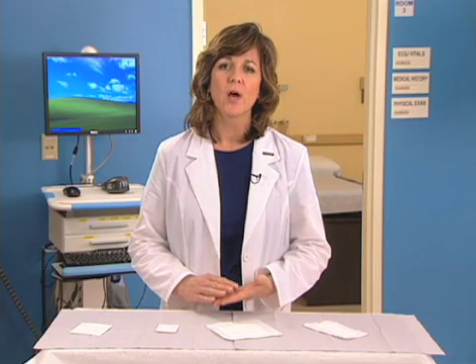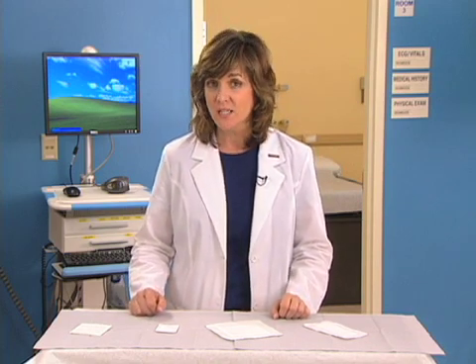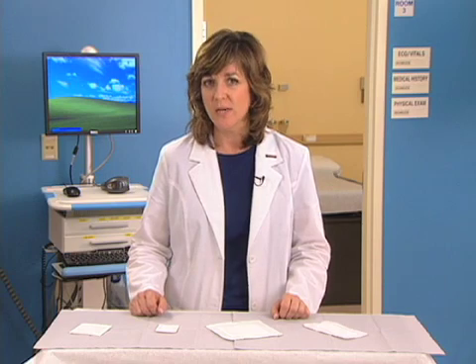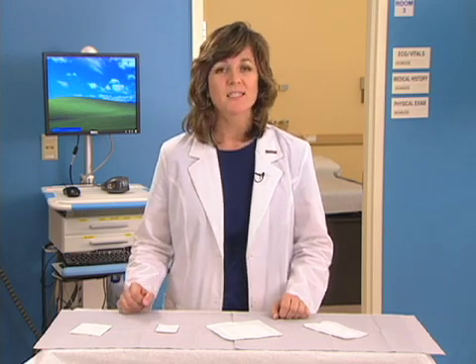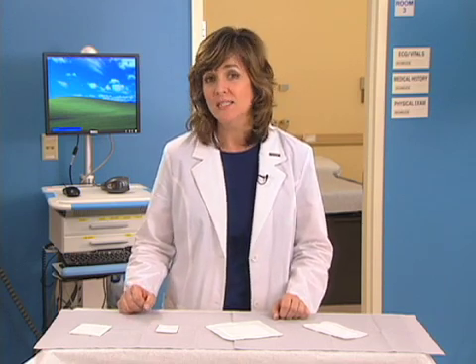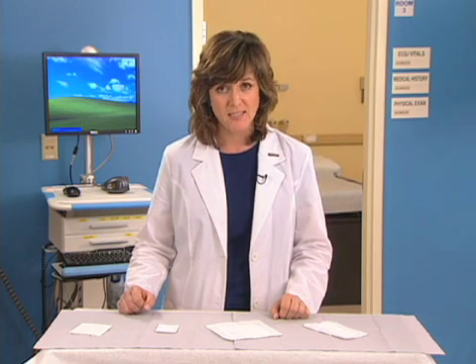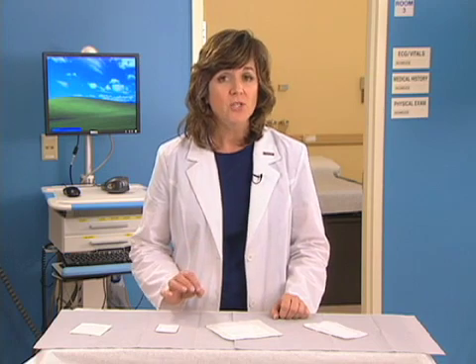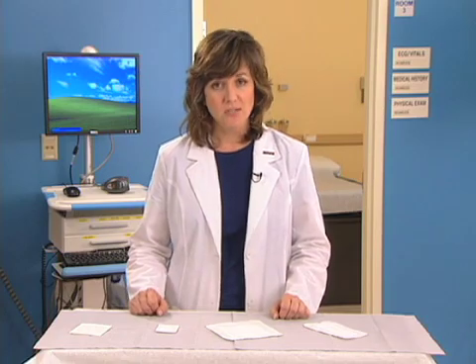As with all wound products, composite dressings also have a number of drawbacks, including contraindications in infected wounds and in patients who are very dehydrated or those with fragile skin, usually elderly patients. To conclude our presentation, we will take a look at how composite dressings should be applied in practice. As these dressings are all different, it's important that the manufacturer's instructions are read carefully before the dressing is applied. However, in general, the following steps are taken.